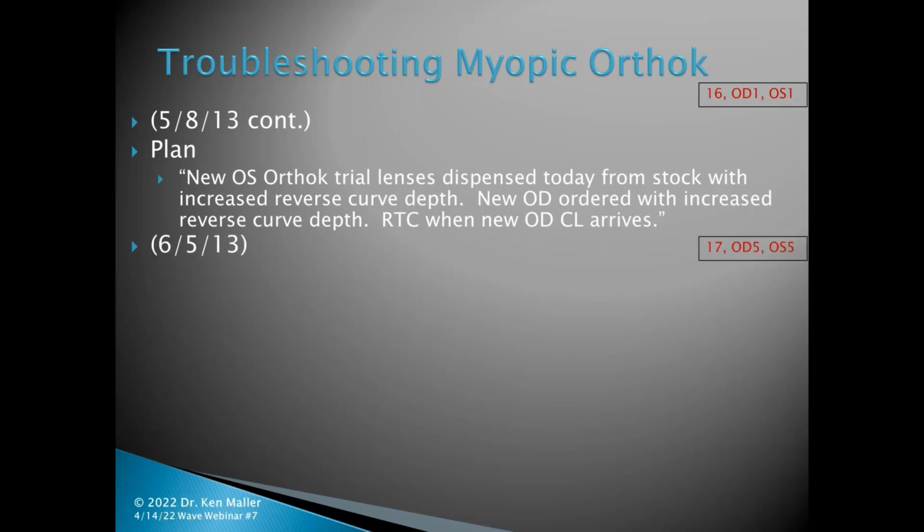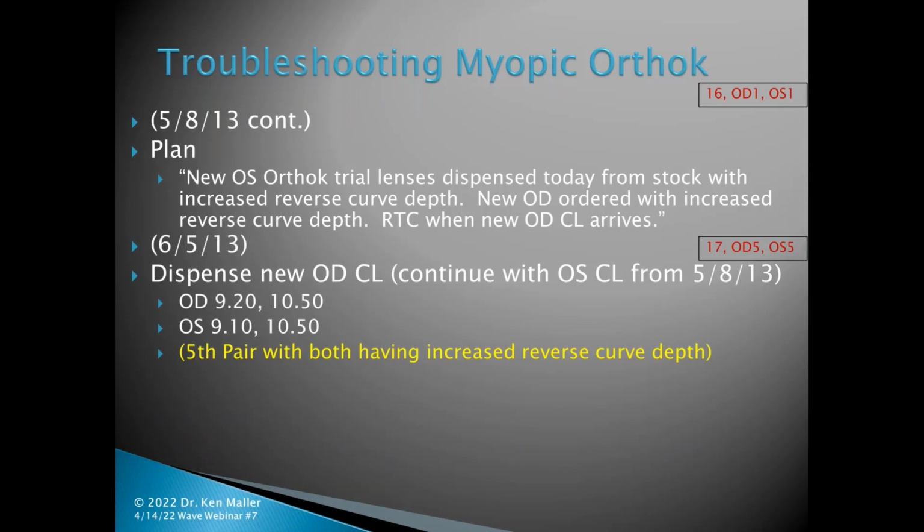So at the 17th visit, he has OD number 5 and OS number 5. This is in June. They dispensed the right lens, and he continued wearing the left lens from 5/8. And so these are the 5th pair of Ortho-K lens that he has now, both having the increased reverse curve depth. Come back in 1 week.